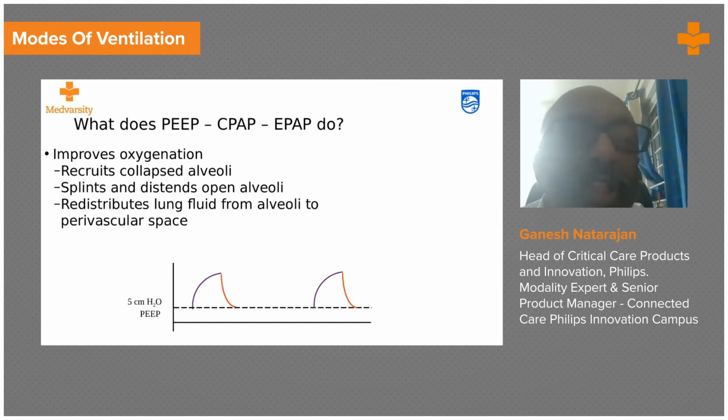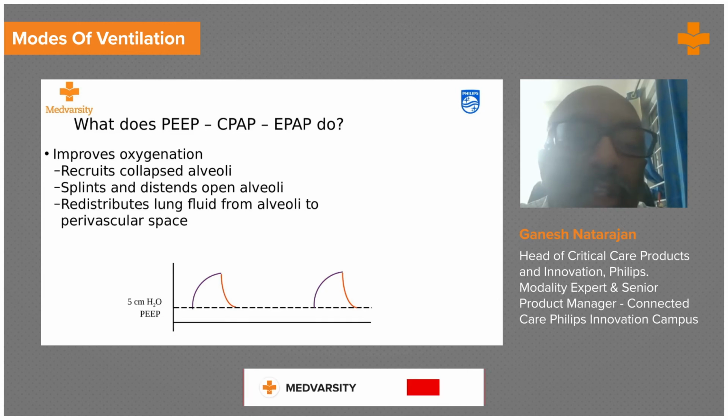If no questions, then there is always this confusion about what is PEEP, what is CPAP in invasive, and what is EPAP in non-invasive ventilation. Basically, all three of them improve oxygenation. All three of them support in recruiting collapsed alveoli.